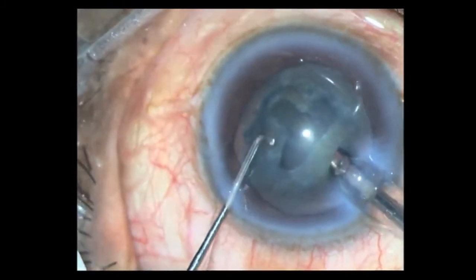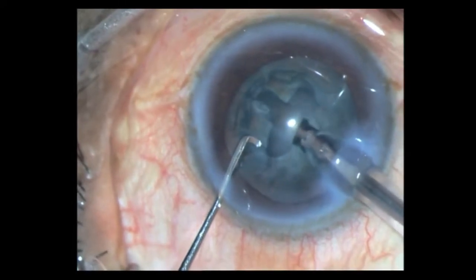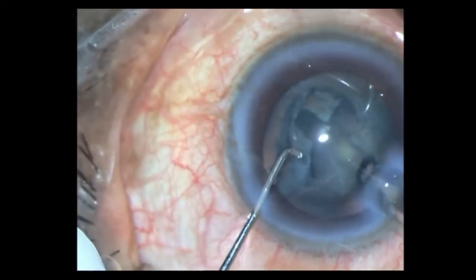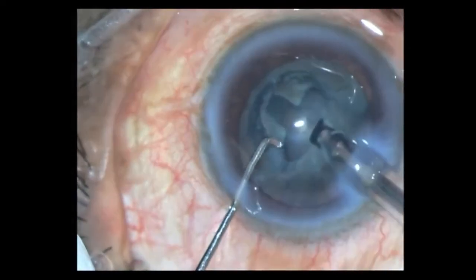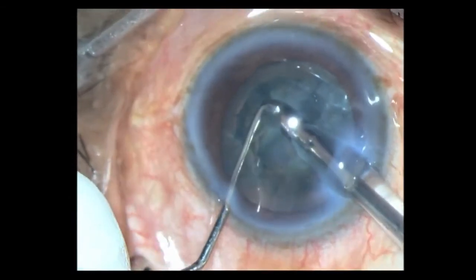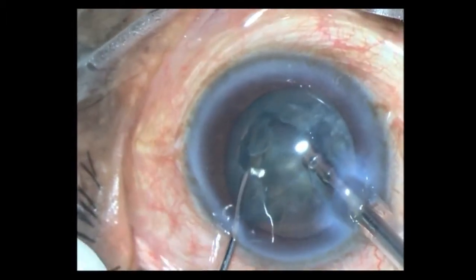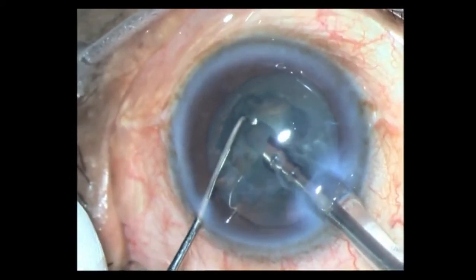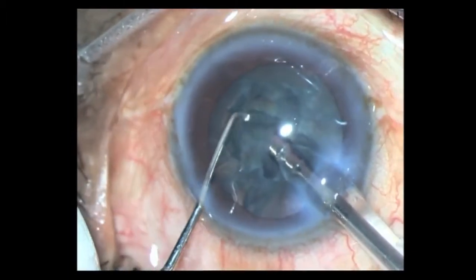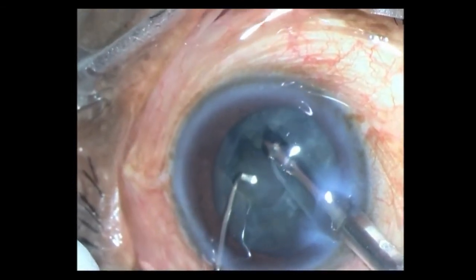Since this is an educational video I'm going a bit slow, just making sure I have deep enough trenches to crack the nucleus. There's the first crack — I rotate it around 180 degrees for the second crack, giving two hemi-nuclei. Then the third, and finally rotating it to get the fourth quadrant as well.